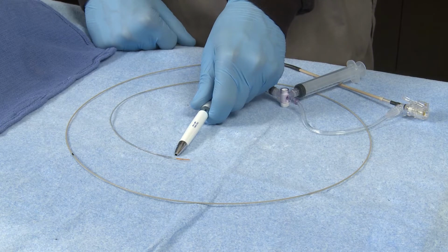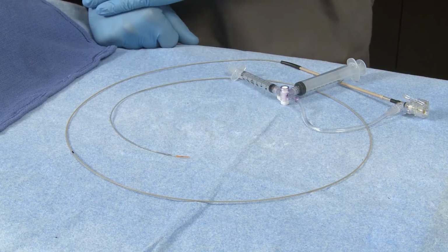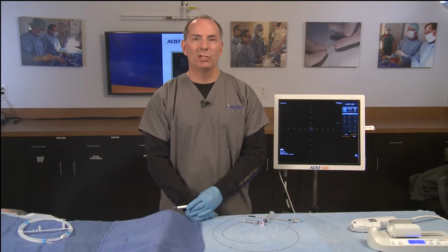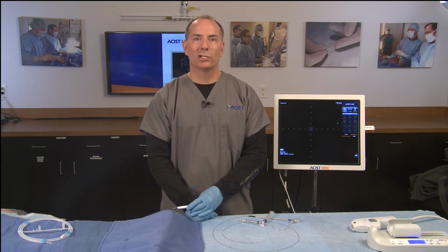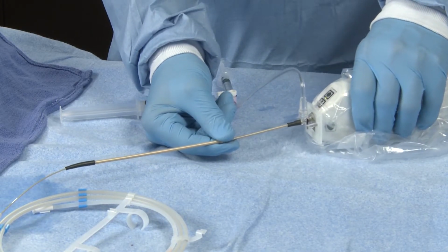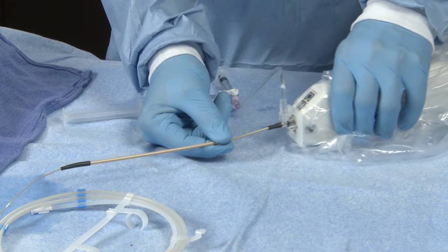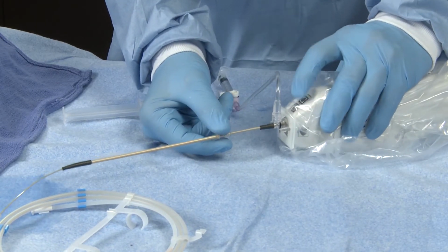The transducer is attached to the distal end of the drive cable located within the body of the catheter. The drive cable is mechanically rotated by the HDI console and continually rotates through 360 degrees. Additionally, the imaging element can be longitudinally translated along the 12 centimeter imaging window by extending and collapsing the telescope assembly. This mechanism allows for examining the vascular tissue along the length of the artery without moving the catheter.